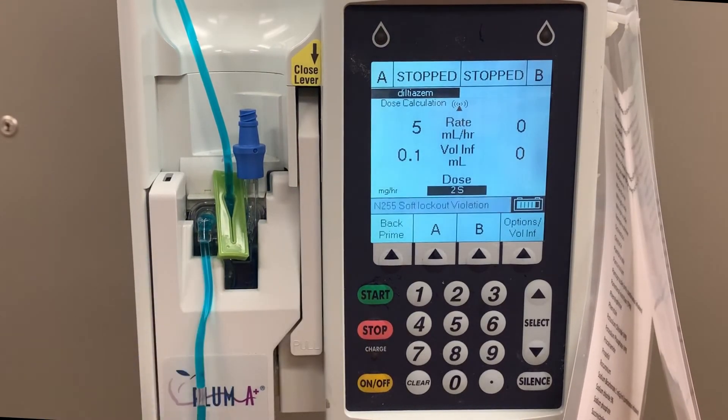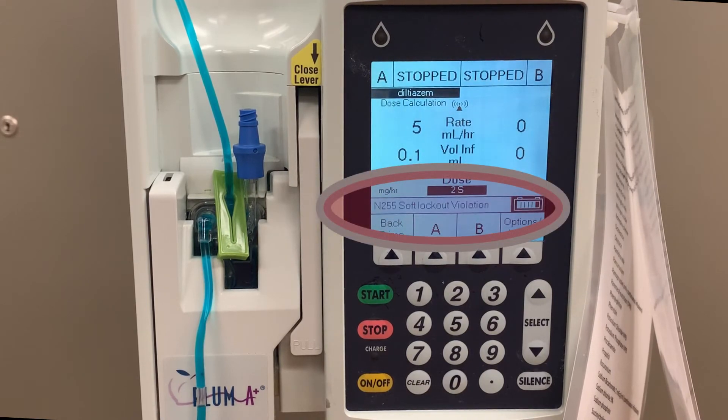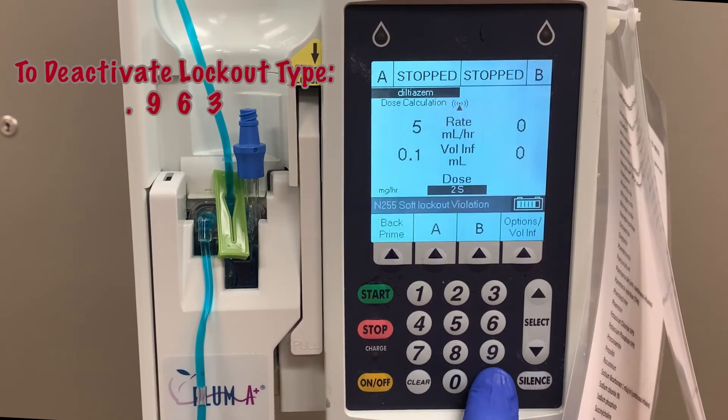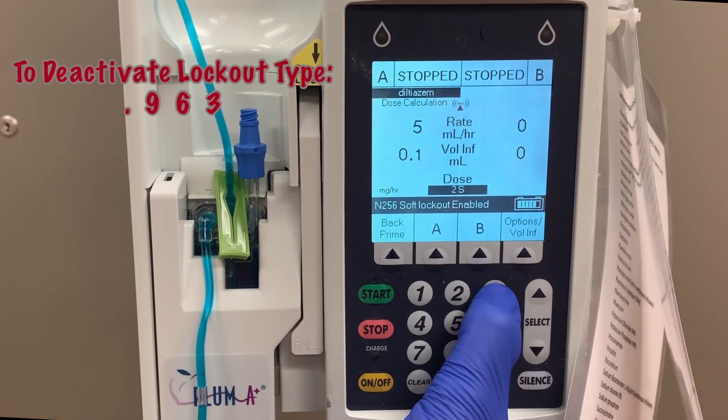Now, just as with the hard lockout, any button pressed on the keypad will not function, and soft lockout violation will appear on the screen. To deactivate the lockout, again, in sequence, press decimal point 963.